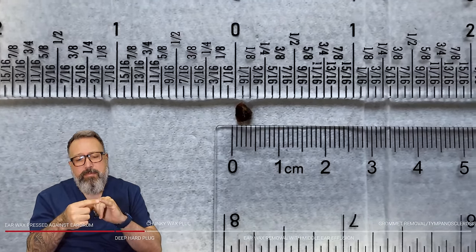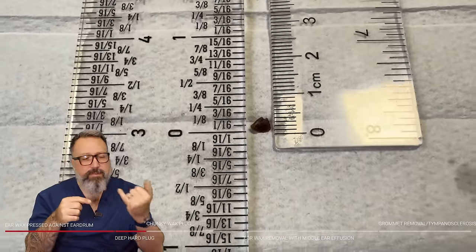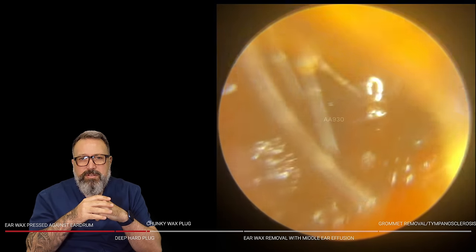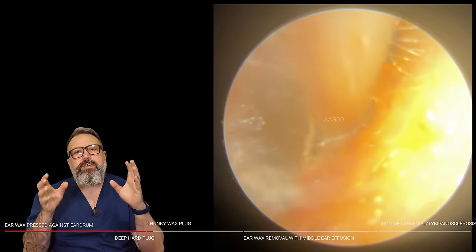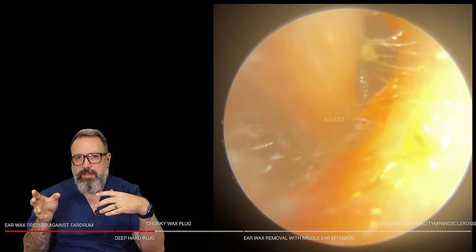Don't forget when we talk about your tympanic membrane — we're talking about the size of the tip of your little finger, just for reference as to how small that is. This piece was about two sixteenths, roughly half a centimeter or just under. We've got a very different consistency here — very soft wax compared to this very hard wax that was deep against the drum.